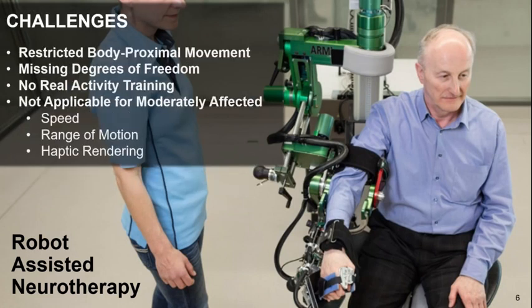However, these devices had substantial limitations. Movements close to the body were often not possible, even though these are highly important for the early rehabilitation process. The supported movements were restricted due to missing degrees of freedom. Interactions with real objects during training were not possible, and robots were not fast enough for treatment with moderately affected patients.